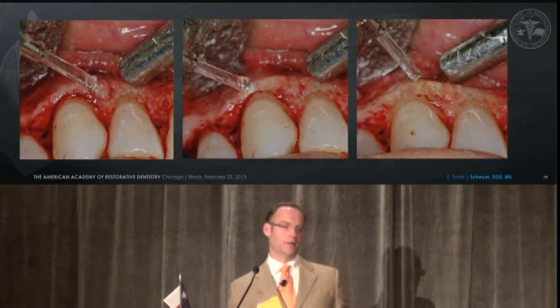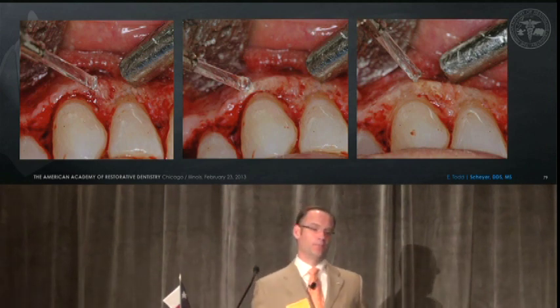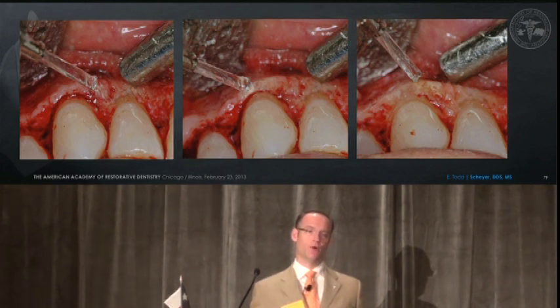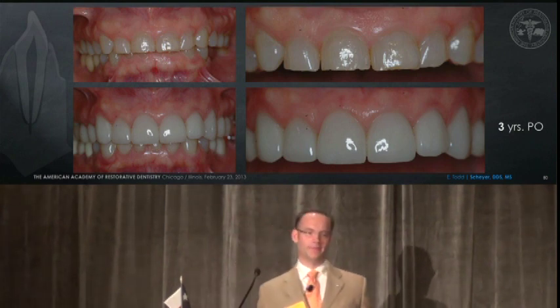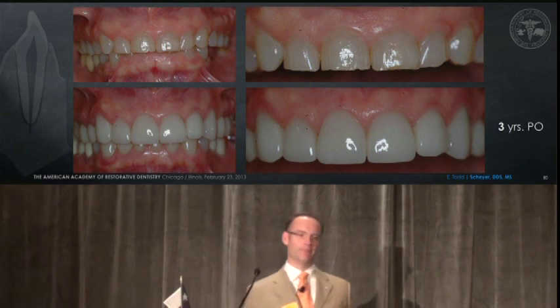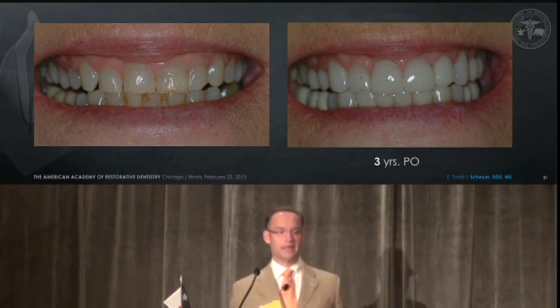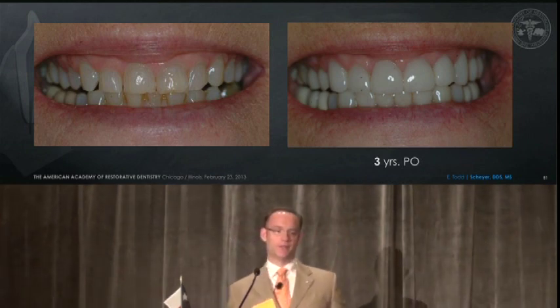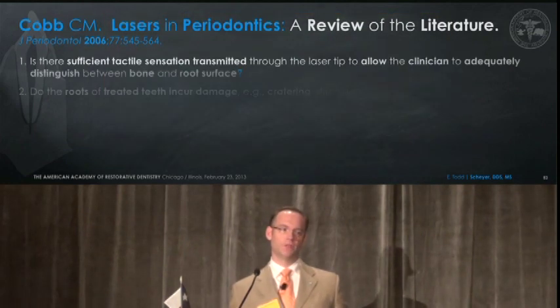Here we are recontouring our osseous troughs with a chisel tip. It takes a lot of time to do this, but these are wonderful tools to remove bone and not leave behind the same effect that a high-speed burr would. Here we see a three-year post-op. I'll point out that we didn't treatment plan this right — tooth nine should be a bit longer — but it's a happy patient and a nice outcome. I don't know that we could have managed this same outcome and stability at three years without reflecting a full thickness flap.